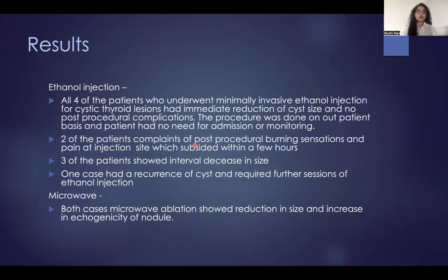So all 4 patients who underwent ethanol injection had immediate reduction of cyst size and no post-procedural complications. The procedure was done on an outpatient basis, and patients had no need for admission or monitoring. 2 of the patients complained of post-procedural burning sensation and pain, which subsided within a few hours. 3 of them on follow-up showed interval decrease in size, and 1 had a recurrence of cyst, which required a further session of ethanol injection. In microwave ablations, both cases showed reduction in size and increase in echogenicity of the nodule.